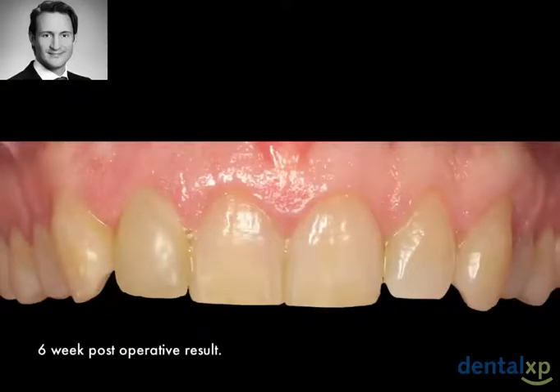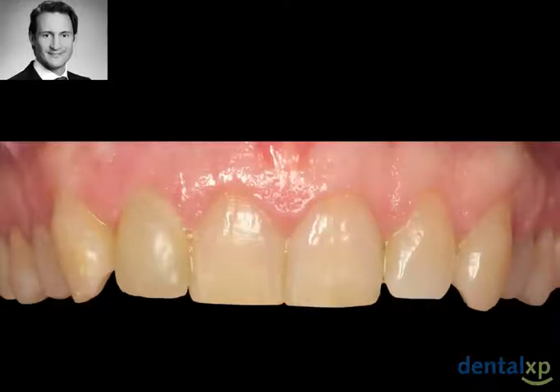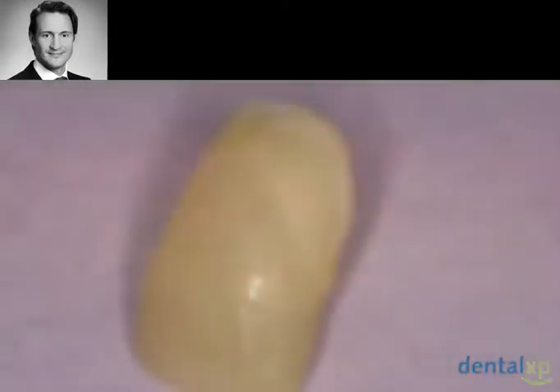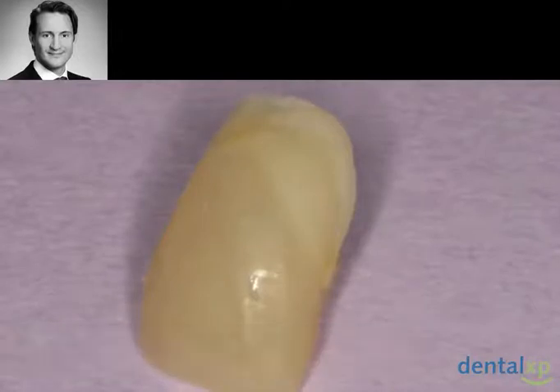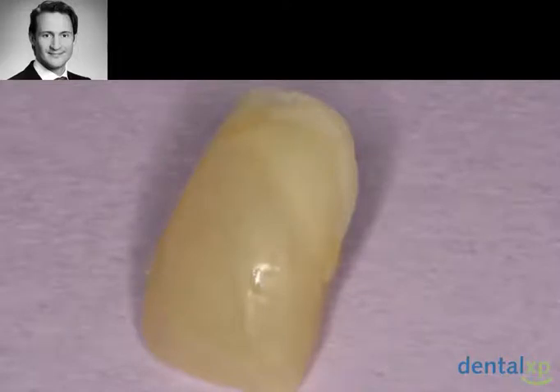Here is a 6-week follow-up photograph. You can see the supported gingiva and the excellent papilla fill in this area. Typically, I will see patients back 2 weeks, 6 weeks, and 3 months after this type of procedure. In this patient's case, he had failure of the cement at approximately 8 weeks, and I took a photograph of the provisional removed. You could see the margins have held up well.